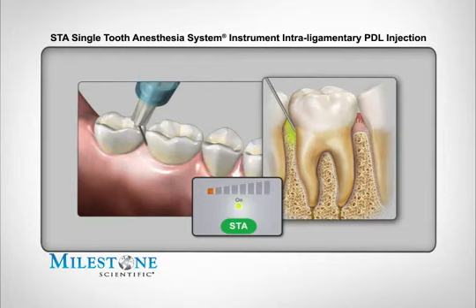Advance the needle forward slowly into the sulcus. Move the needle gently down into the sulcus until you reach resistance. Maintain approximately a 45-degree angle while holding the needle in place with light hand pressure. Do not use excessive hand force on the needle, as this may block and clog the flow of anesthetic solution from the needle. Carefully control and stabilize needle movements using a finger rest.